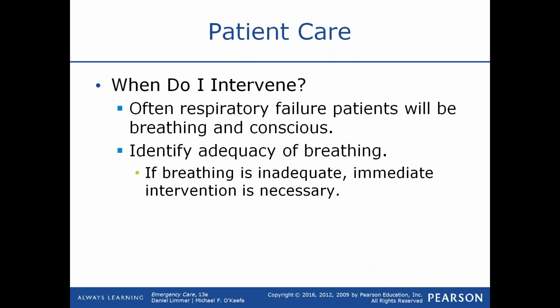Excuse me, I always say bagging. That's an old term. We bag groceries. When do I ventilate a patient? For me, it's if I see those signs of impending respiratory failure, then it's definitely time to start ventilating the patient. Initially, in a patient who is short of breath, you may start off with an oxygen cannula or oxygen by mask, but at some point, if they don't improve, you may have to assist their ventilations. So initially identify the adequacy of the breathing. If the breathing is not adequate, then we need to intervene or they will become hypoxic and die.